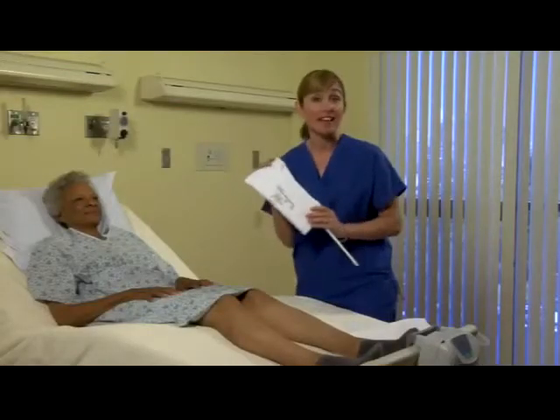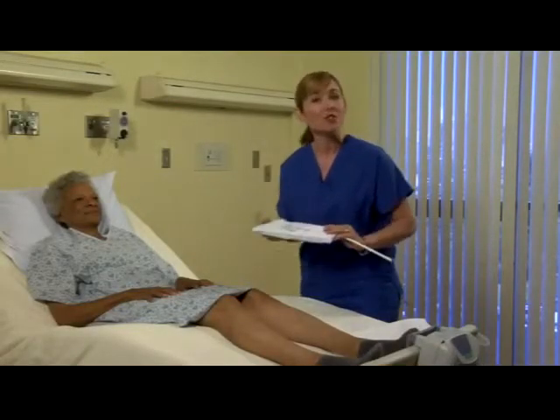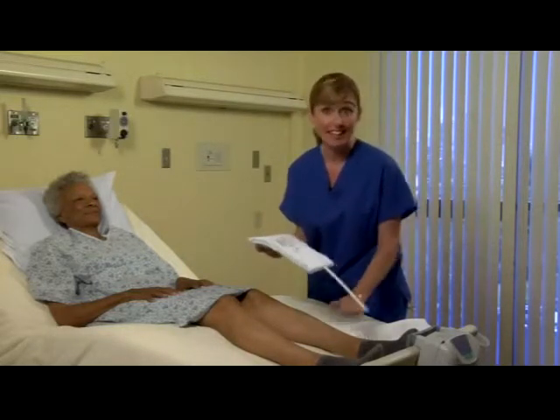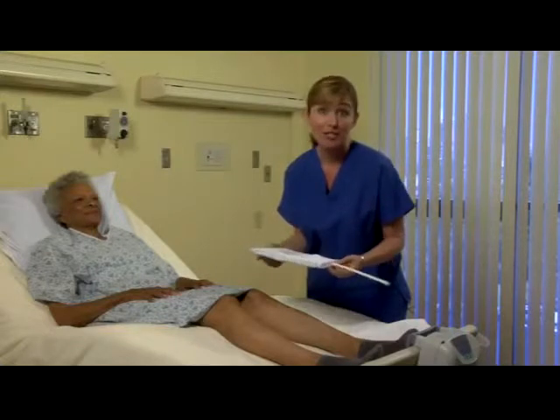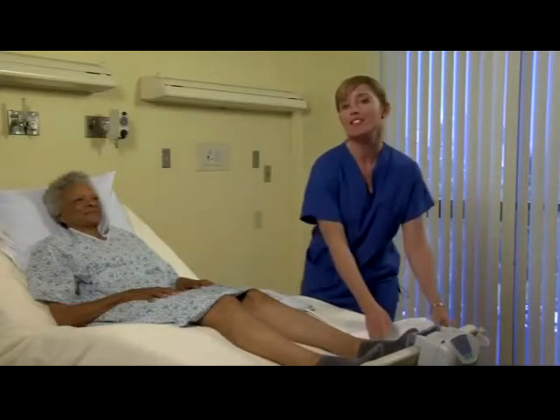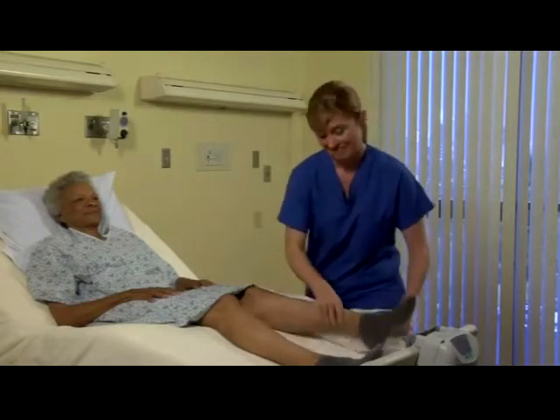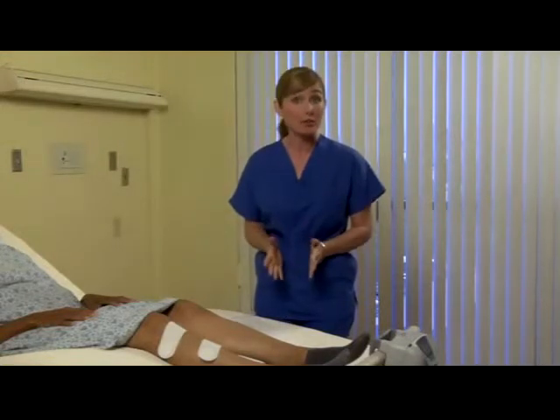The next step is applying the cuffs. Apply the cuffs with the tubing pointed towards the foot. The cuffs are hypoallergenic and may be placed directly against the skin or over a leg compression stocking. The performance of this device is consistent no matter where the air cell is placed. You may place the cuff in a posterior, anterior, or lateral position.